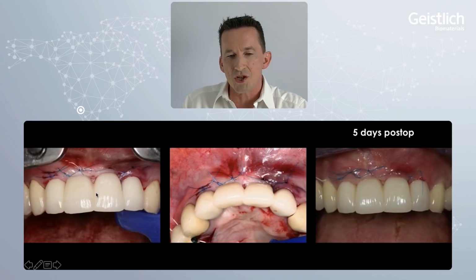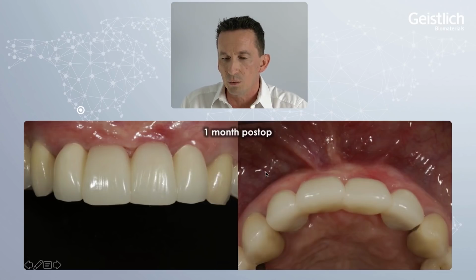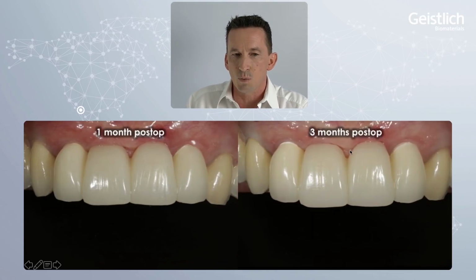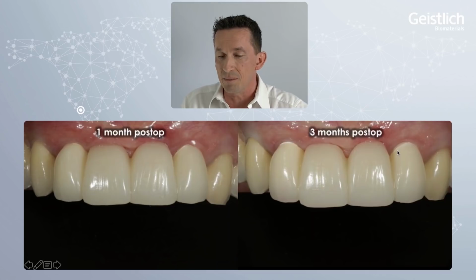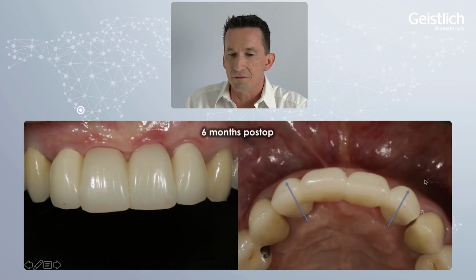This is the situation after the surgery. That's the situation 5 days later. And now have a look at the 1 month result. This is the site with the connective tissue graft. This is the site with the Fibro Guide. That's the 1 month result. That's the 3 month result. That's the 6 month result.